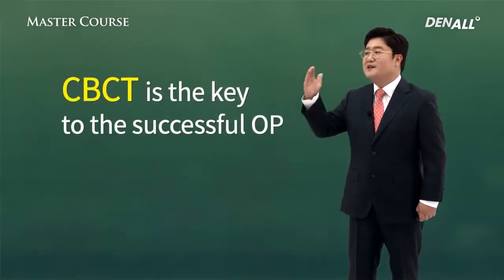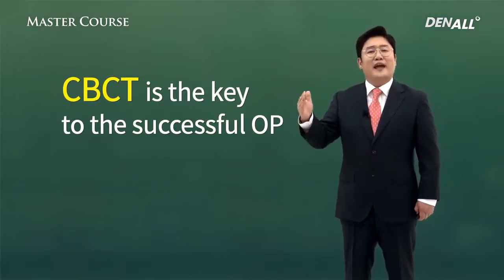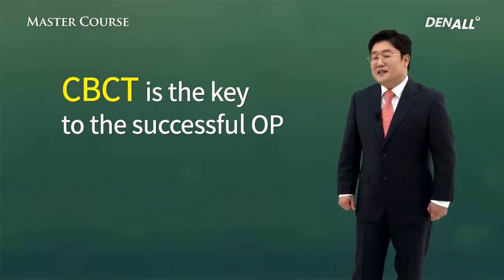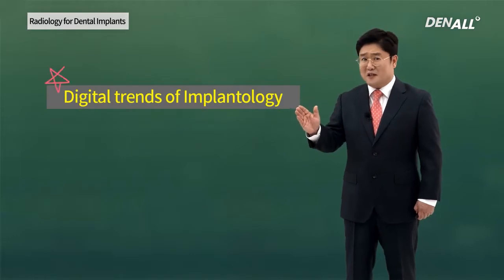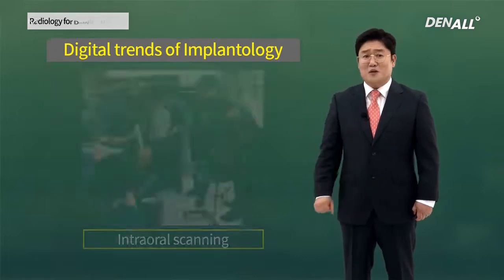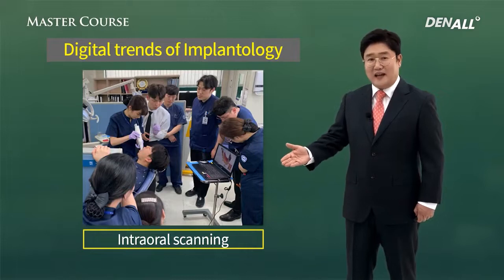CBCT development has led the implantology surgical field as well. CBCT is the key to successful implant surgery. I can say that for sure. As you know, the conspicuous trend in implantology is digital. If you do not know about digital, you may not be able to join the hot discussions.